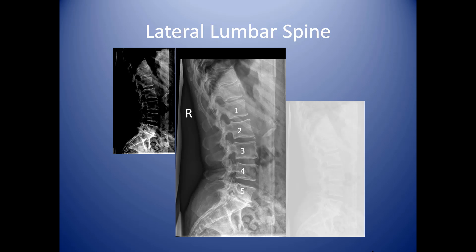Here is an evaluation of the lateral lumbar spine. We enumerate the vertebrae counting back from the sacrum — that triangular-looking bone at the bottom — counting 5, 4, 3, 2, 1. You can also use the spinous processes in the back to help count, especially if a patient has a crushed spine and counting is difficult. This film is marked 'right,' indicating that the patient's right side was down on the table. Whichever side is down against the film is the side you mark.